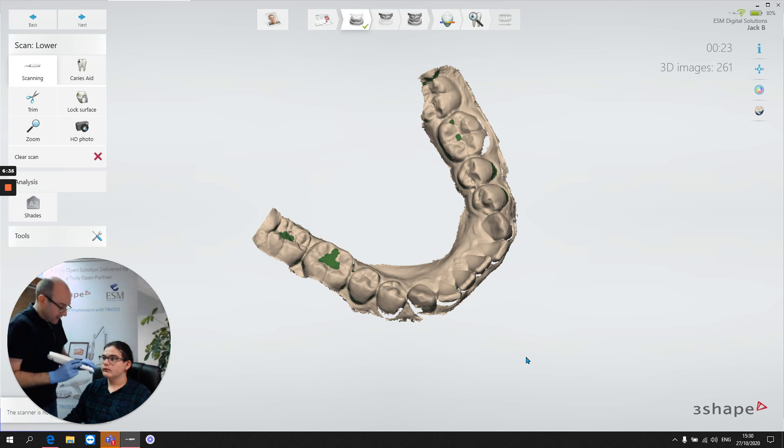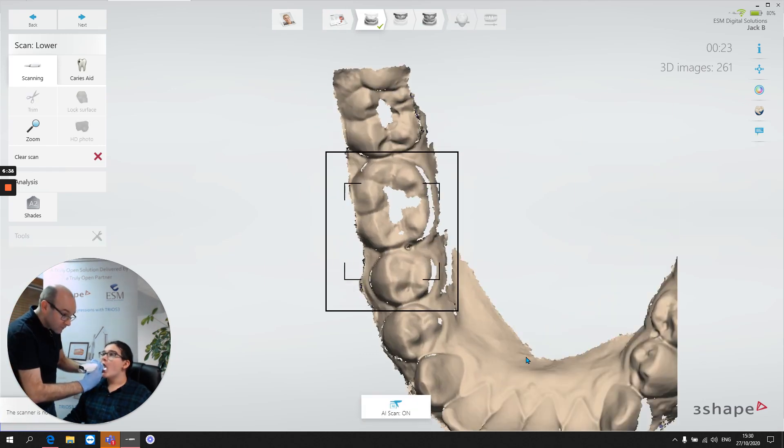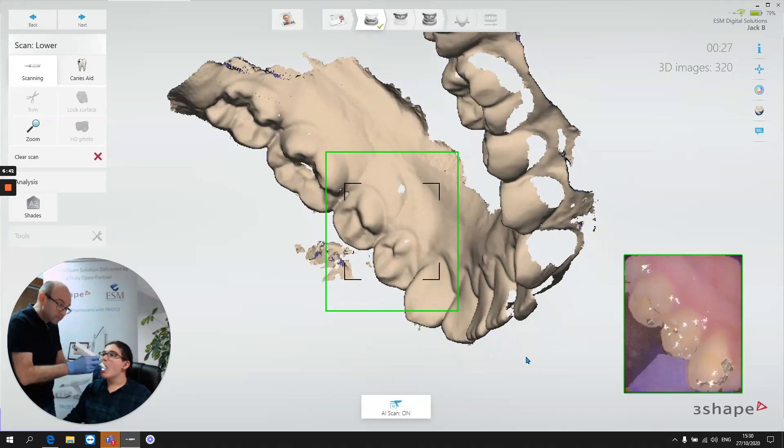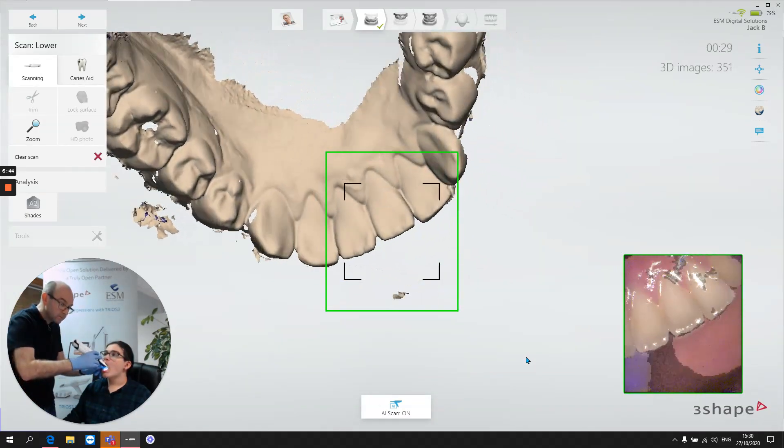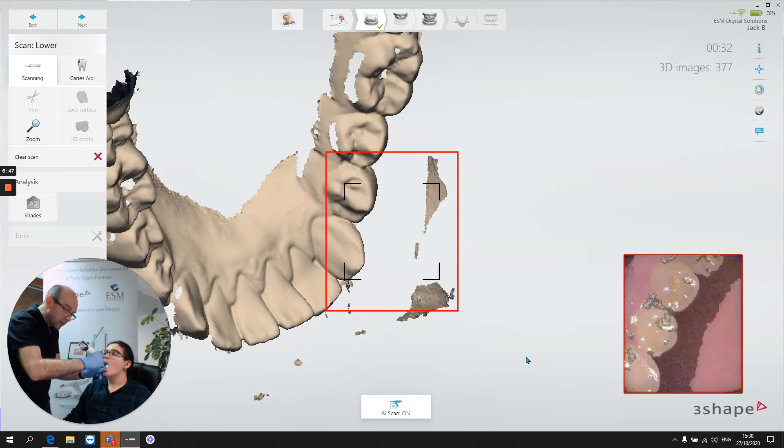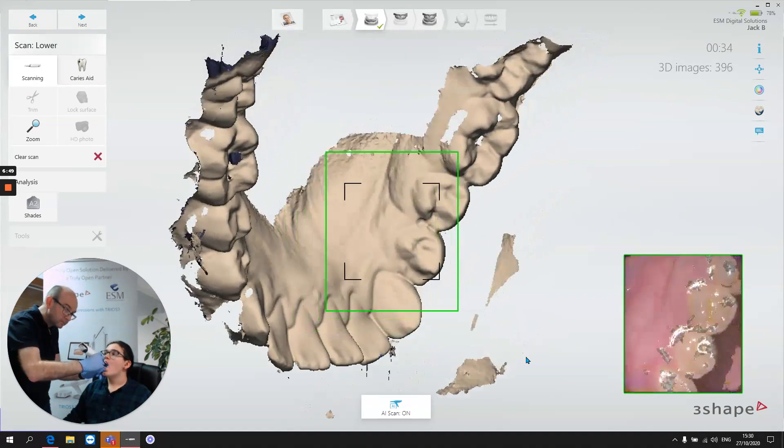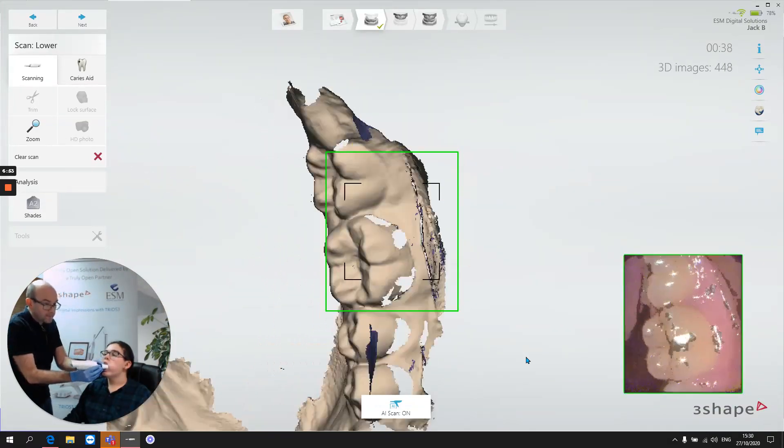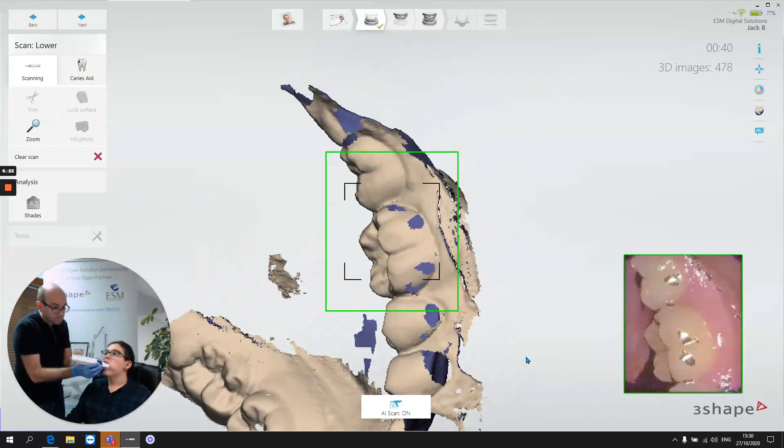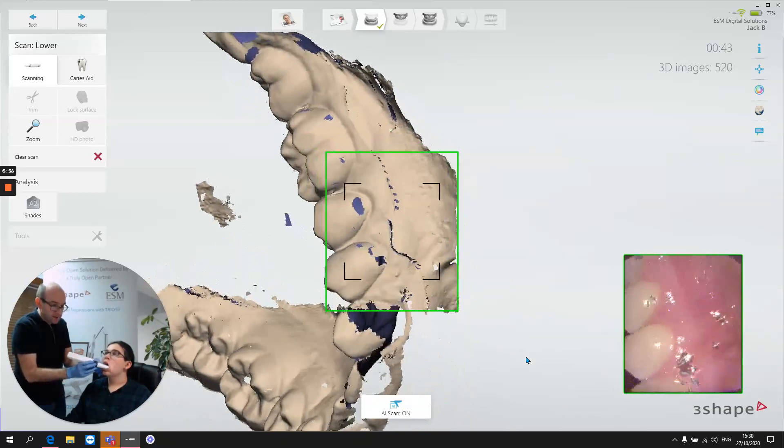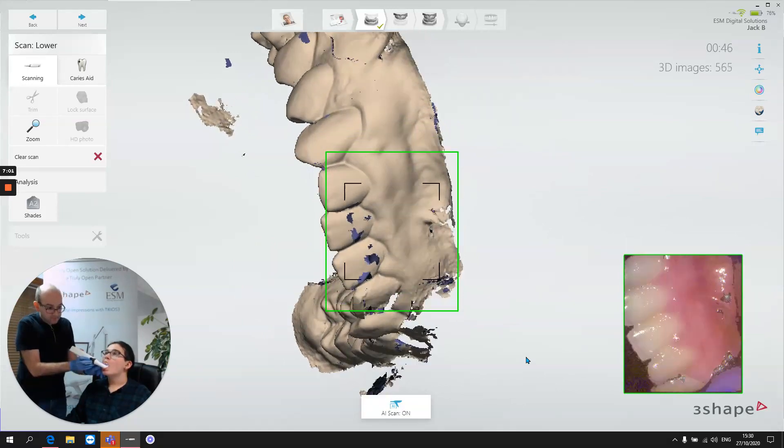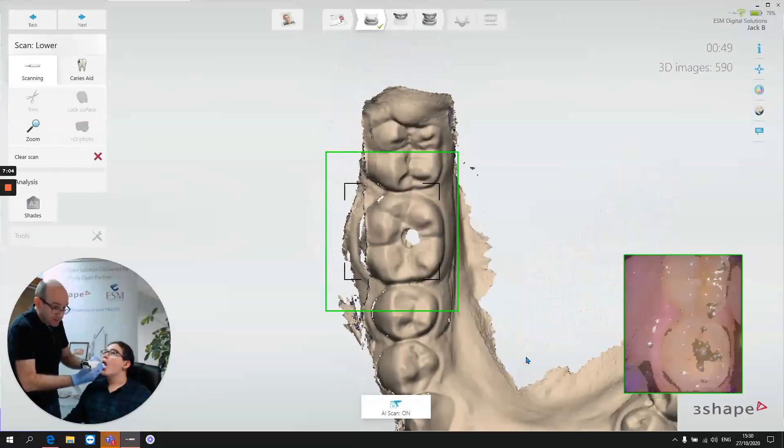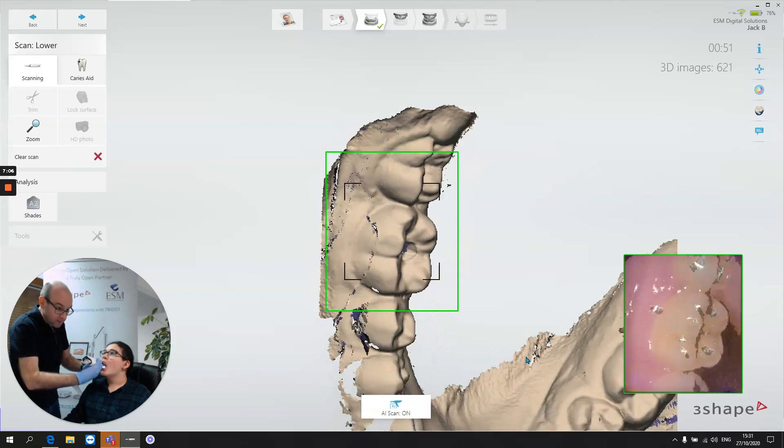So let's complete the scan. We're going to continue on lingually. And then we'll go a little bit of buccal. And we like to do the buccal sweep in two stages. So we can start at the back and come to the midline. And start at the back on the other side and come to the midline.